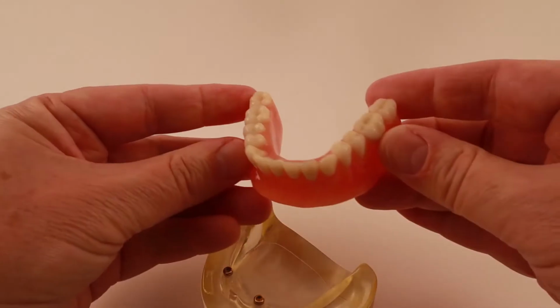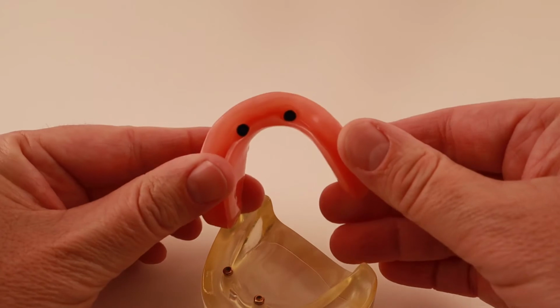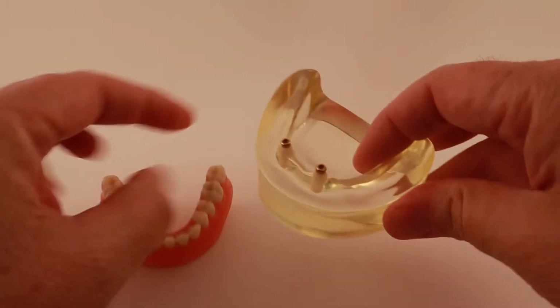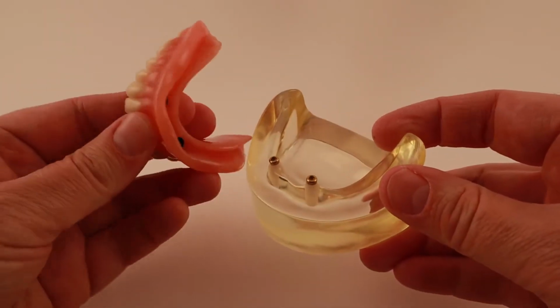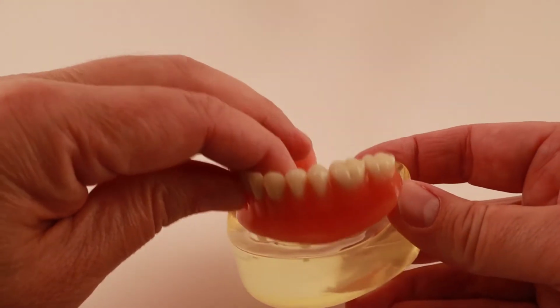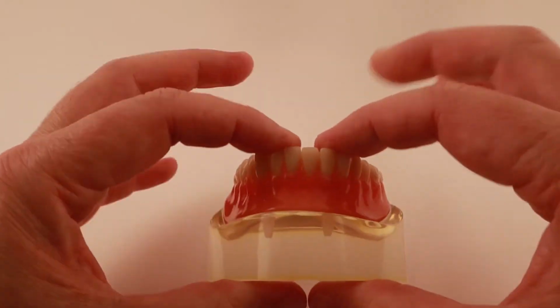In this video, I'm going to explain what is an overdenture. In basic terms, an overdenture is a denture that fits over some implants or over a metal bar that is attached to implants. The fact that you as a patient can remove the denture at home makes it an overdenture.